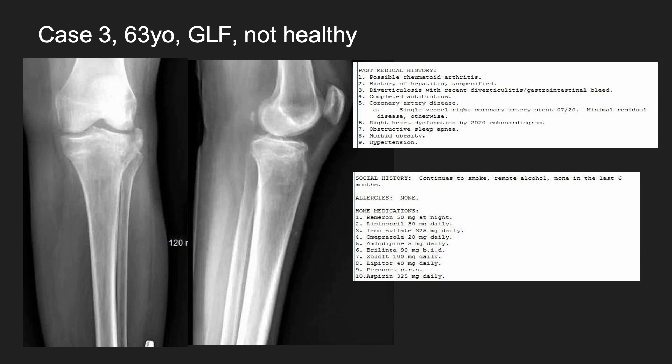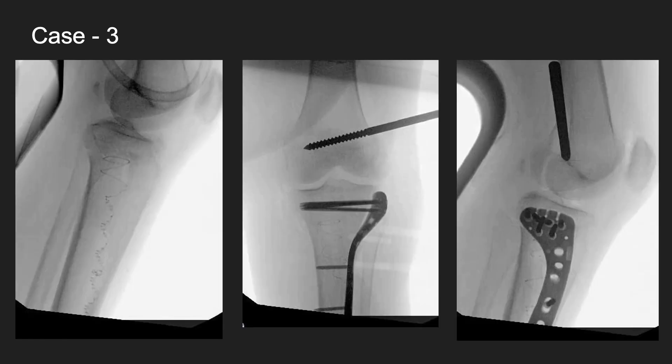She comes in with lateral joint depression and widening, and also a crack in the metaphysis indicating significant osteoporosis and medial column instability that's going to fail with a lateral-only construct. Similar to what you've seen before: femoral distractor, Luminos placed through the lateral side distally, running up into the subchondral bone, deploying the Luminos, inflating the balloon, checking the reduction before curing it to make it hard, then doing the lateral joint work and fixing it with lateral plate and screws.